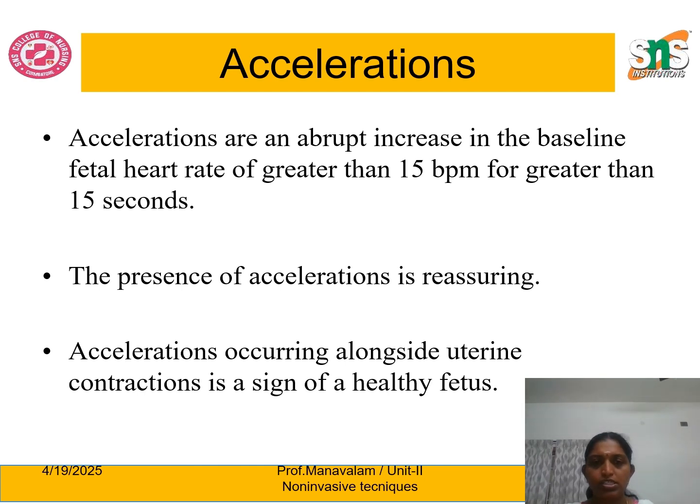So in the previous video we saw about the baseline fetal heart rate. The baseline fetal heart rate lies between 110 to 160 beats per minute. That is the normal fetal heart rate. But sometimes there is an abrupt increase in the fetal baseline heart rate greater than 15 beats per minute. If it remains in that state for more than 15 seconds, then it is called an acceleration.